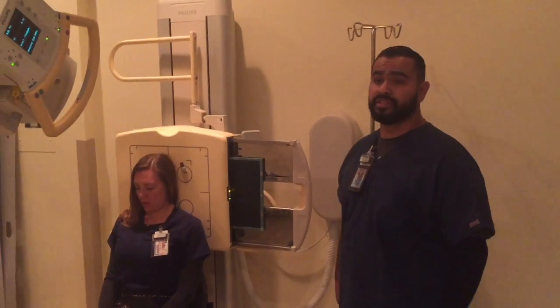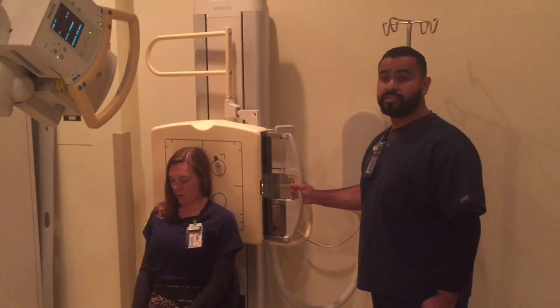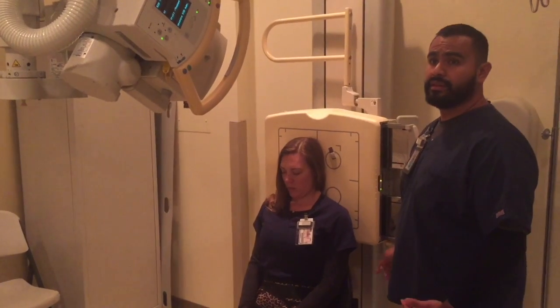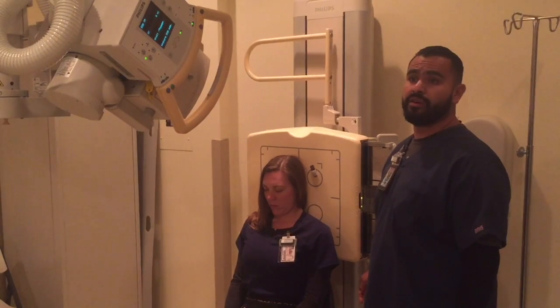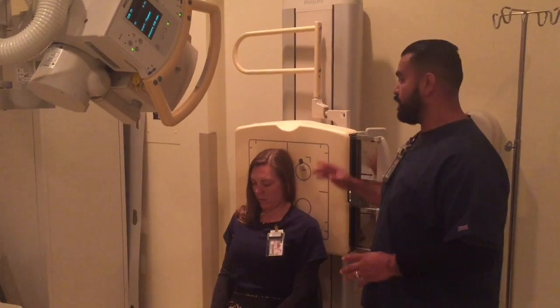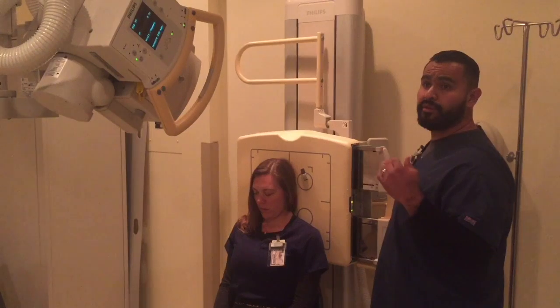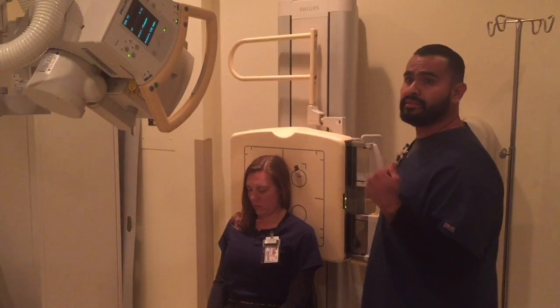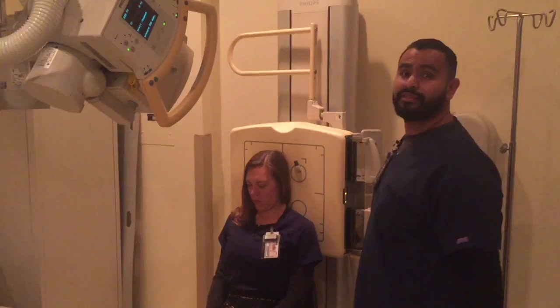Alright, for my next image, I'm going to do an AP axial Towne. And for my AP axial Towne, I'm going to position my patient. And when positioning my patient, I'm making sure that the MSP is perpendicular to the IR. Also, the OML is perpendicular to the IR. And also that there's going to be lead above her head. So this, like I said, the central ray will be about 30 degrees caudad, and it's gonna angle about 2.5 inches above the glabella.